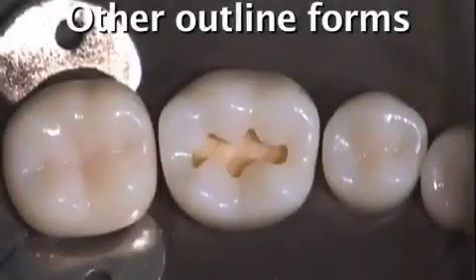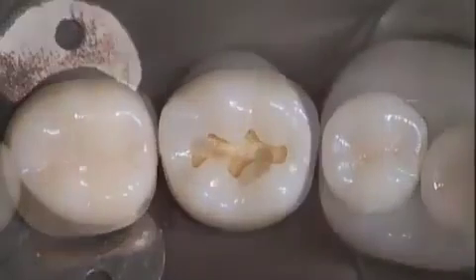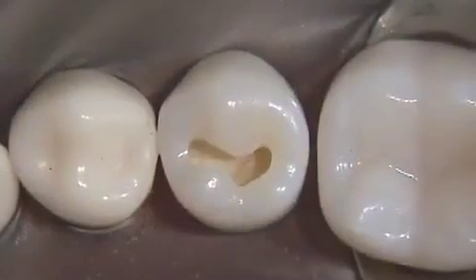Here are some examples of other outline forms depending on the tooth and caries distribution.